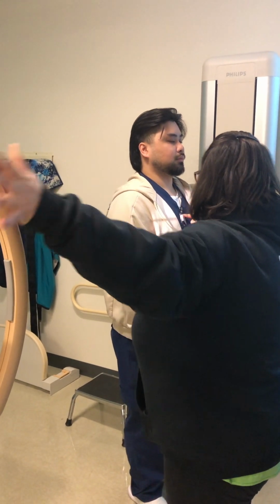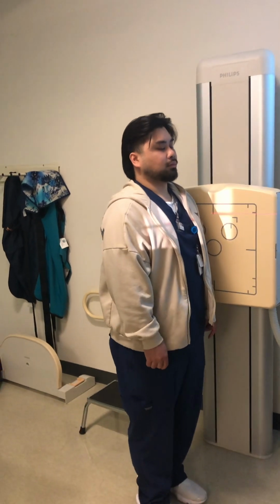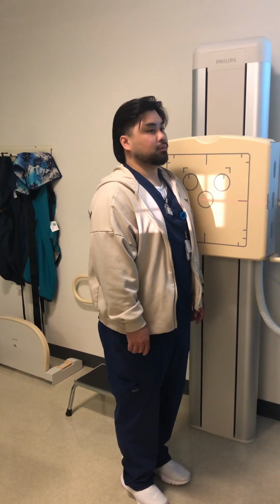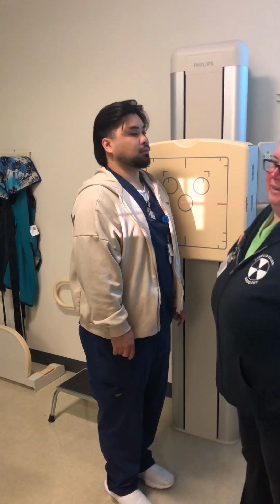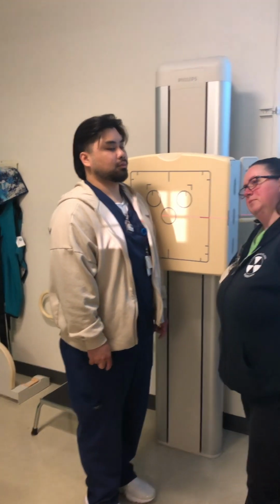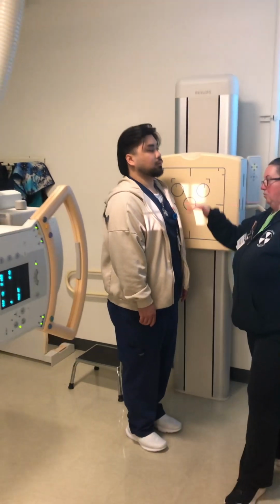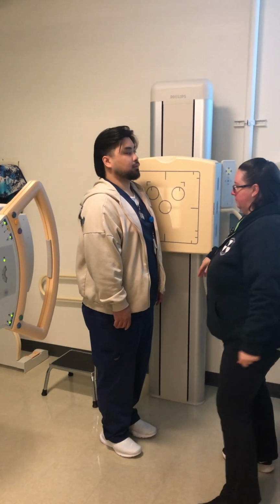If you can't feel the xiphoid on a bigger patient, you just center how many inches from the jugular notch down? I think, again, it's your standard 3 to 4. But each patient's going to be a little different, so make sure that whatever estimation you're using makes sense for your patient. Okay?